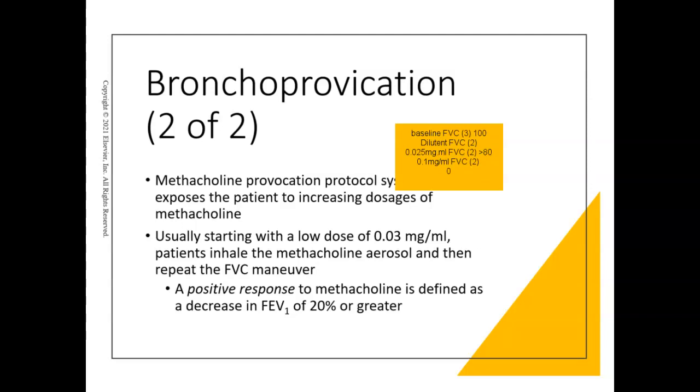And then that's your 0.4. And then you're going to 1.6, then 6.4, and on up to 25. Okay, so that's kind of how you can see how the dosing goes.